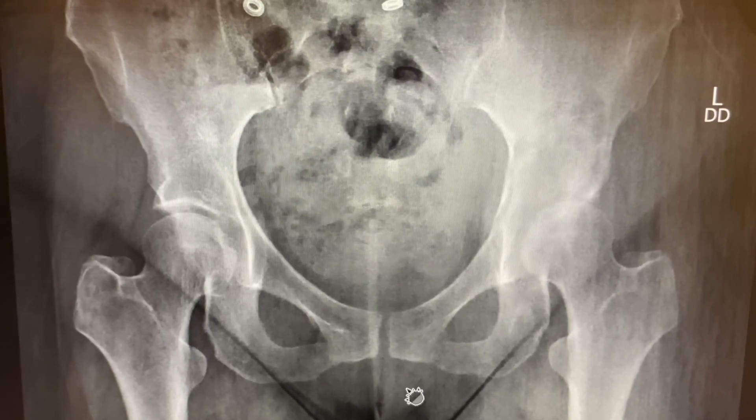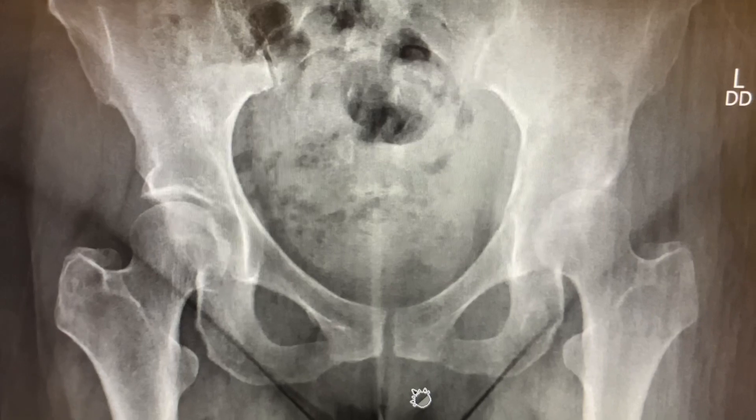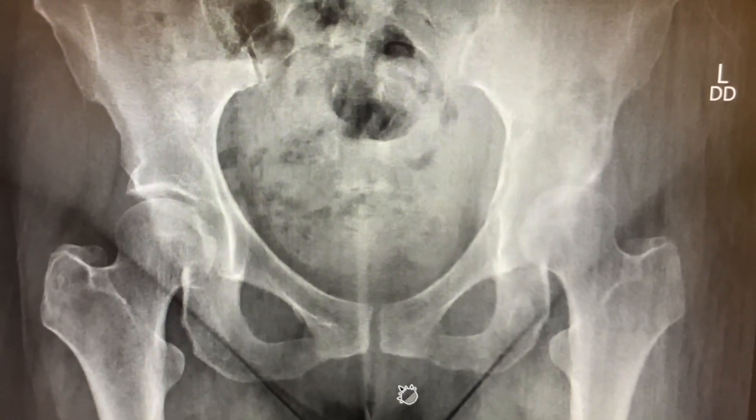This is a 50-something-year-old female patient. She presented with left hip pain. Here you go — this is the AP pelvis, plain x-ray.